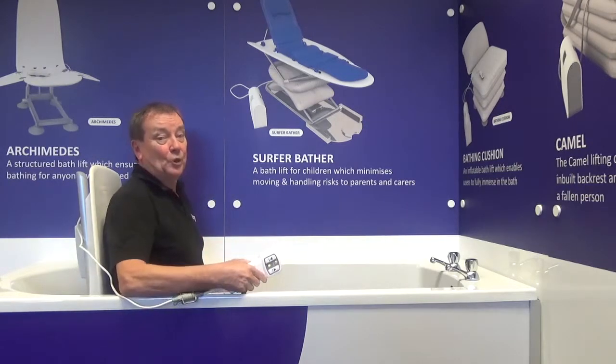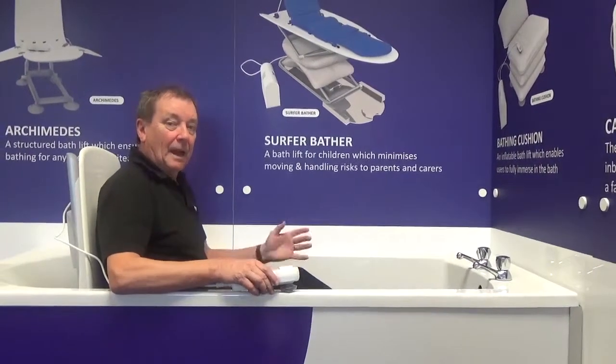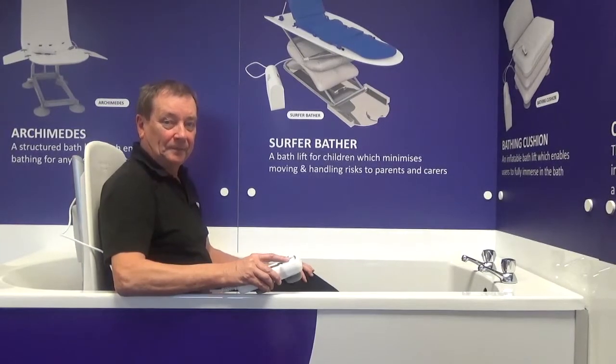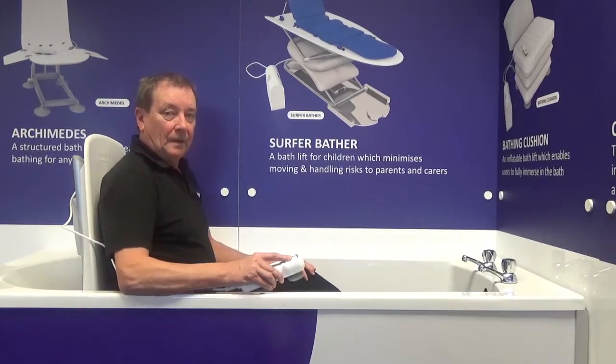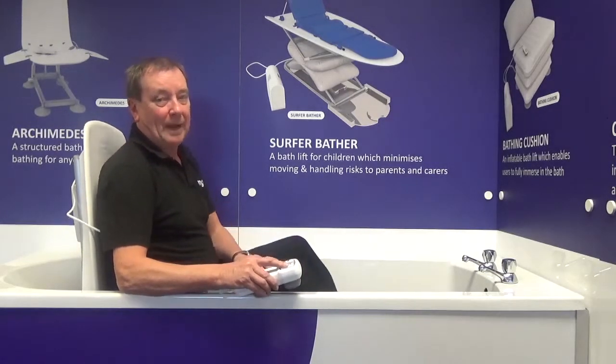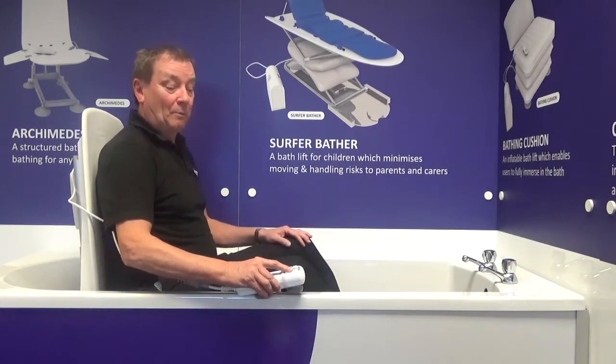I'm actually around 2 inches off the bottom of the bath at this stage. That's because of the frame, but if you compare that with a lot of other bath lifts that are available, that's really quite low. Once my bath is completed, I just return. So, push the up button and I start to rise. The opposite of going down, remember, bring my knees up as soon as I possibly can, just to get my knees a little bit higher than my hips. That helps even more with the stability.